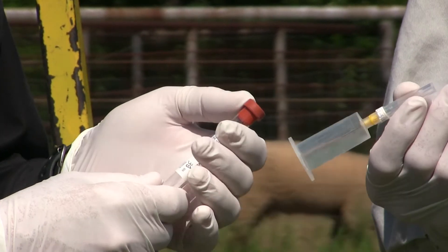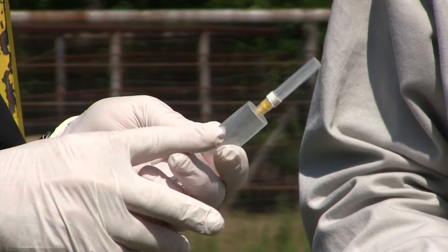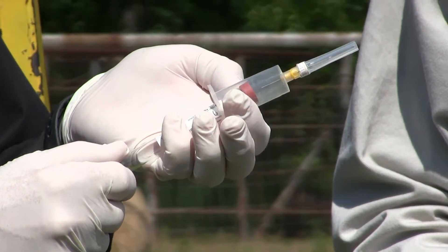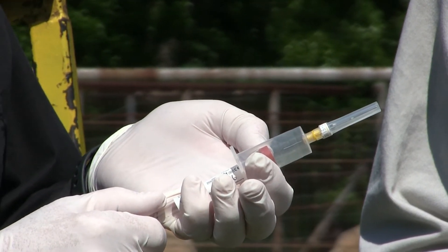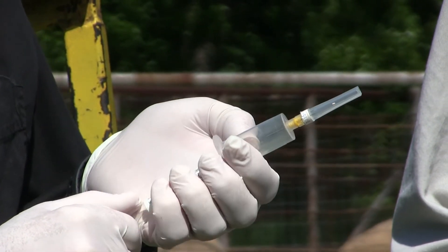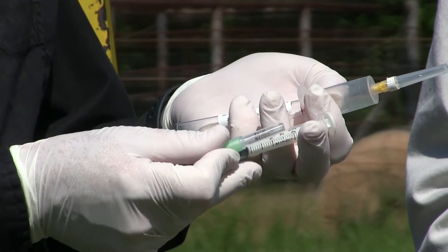To pull blood we need a vacutainer that has a needle on it, and we change those out each time. You stick the animal and the vacuum in the tube will pull blood right into it — we need about 2 cc of blood to send off to the lab. If we don't have a vacutainer and tubes, we can also utilize syringes and a disposable needle.